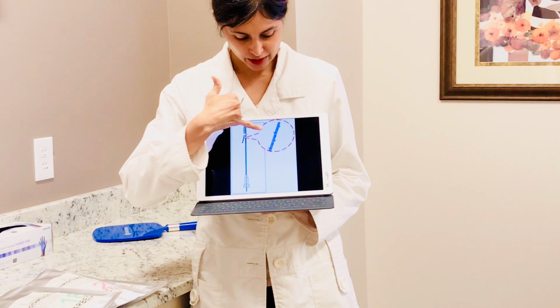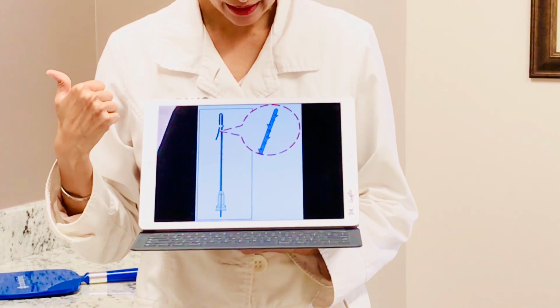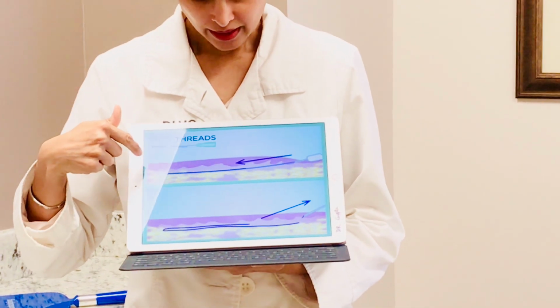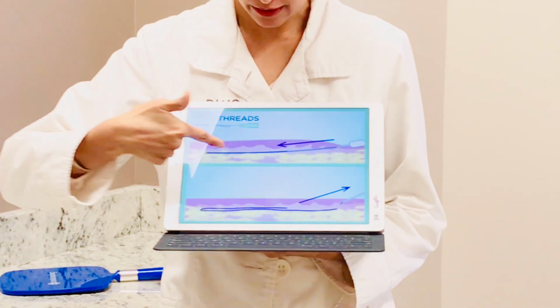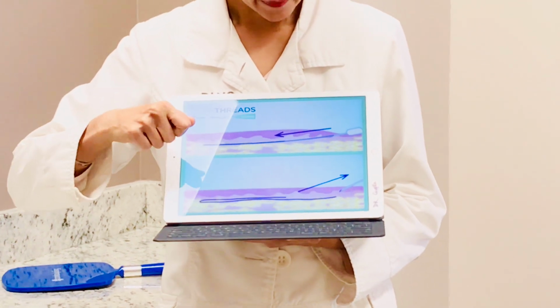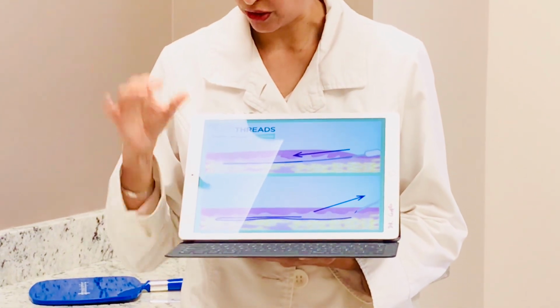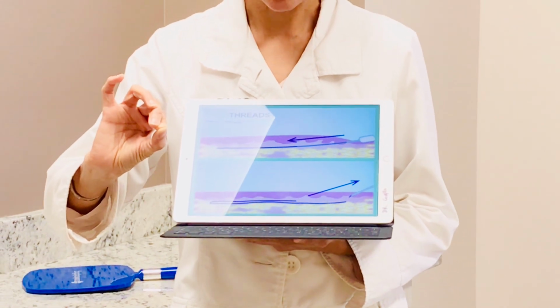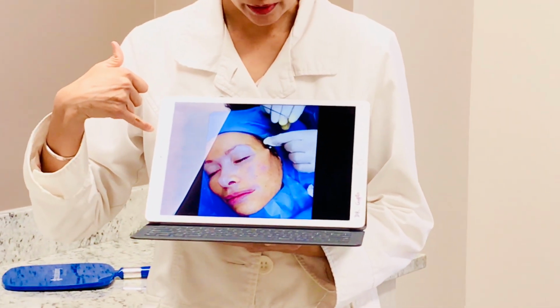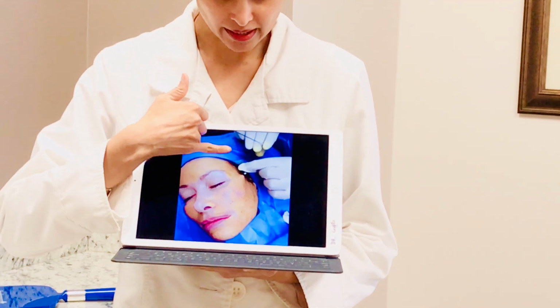This is just a close-up showing what the barbs look like on the barbed PDO threads. And they're really not so scary, but they do give good anchoring to the tissue once they're just kind of tugged back and pulled back. This is how the thread is actually administered. So it goes in one direction, and after you reach the end of where the thread needs to be placed, it gets released and the cannula gets pulled out and the thread is left behind. So essentially it is going with a little blunt cannula that holds the thread, stays in the skin, cannula comes out, thread stays in. This is an example of what the procedure might look like, with the thread being placed and then being gently tugged back.